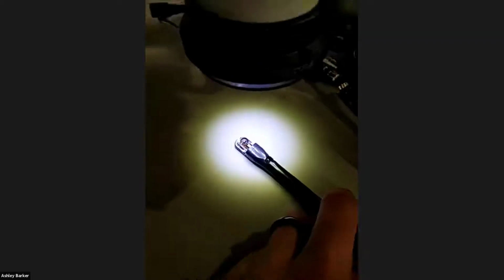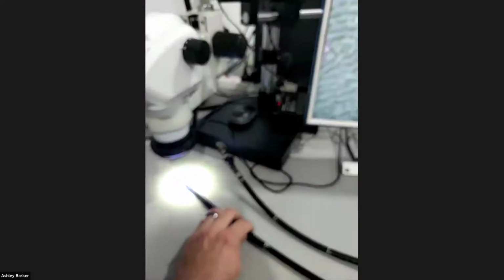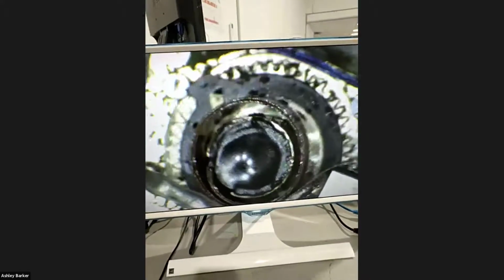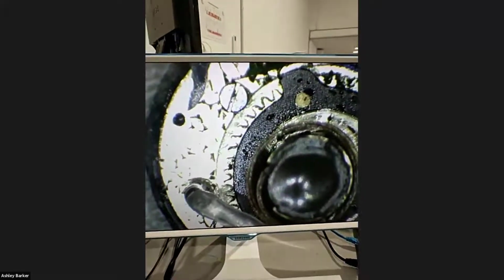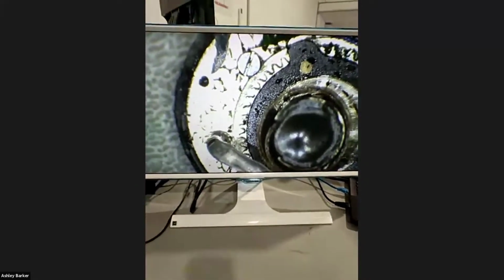All right. So this is the tiny little tip, which you're not going to be able to see very much through a phone. So I've got it sitting under the microscope, and then I've got the microscope feed up here. It looks like the back of a watch or something.